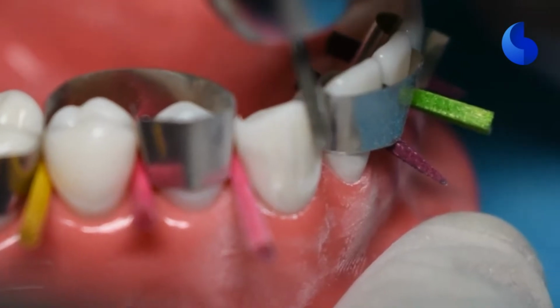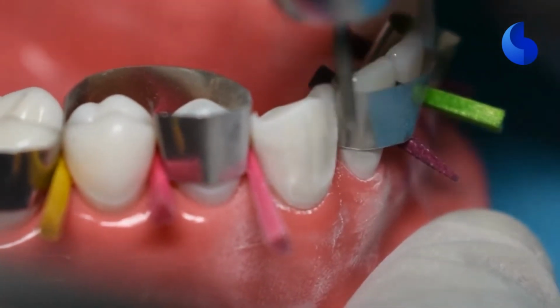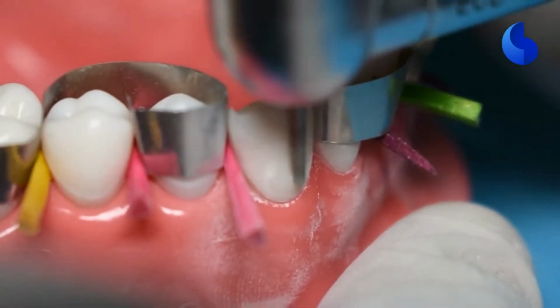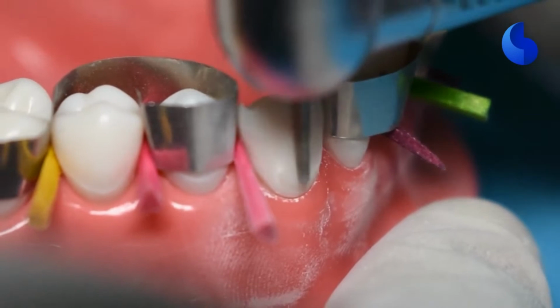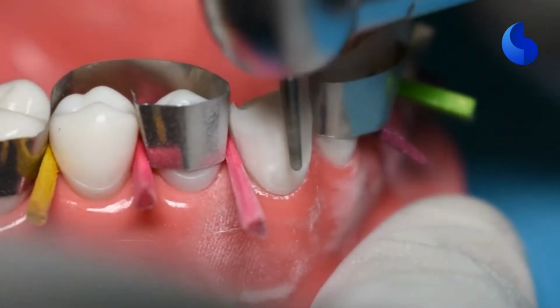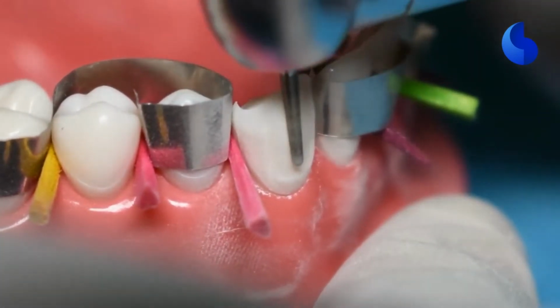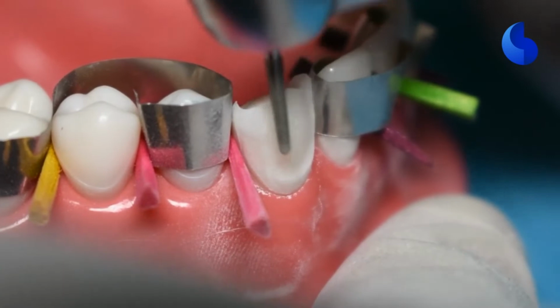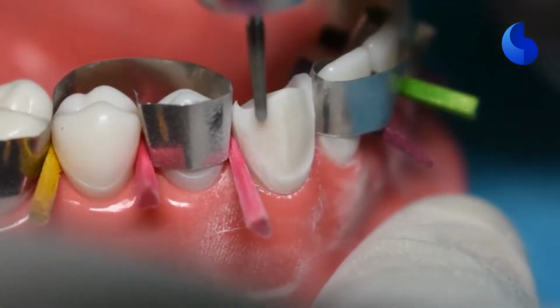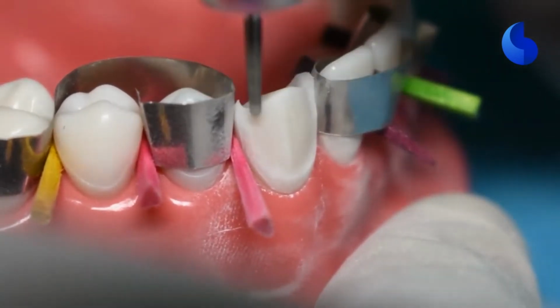So a good way to practice this is when you're preparing the cervical component, you can sometimes align your burr with the lingual axis of this tooth and then transfer that onto the facial cervical component, because whatever path of placement you place at the cervical component on this facial surface, that's the angle in which your lingual axial surface also needs to be so that you don't have any undercut. That is one way of ensuring that.